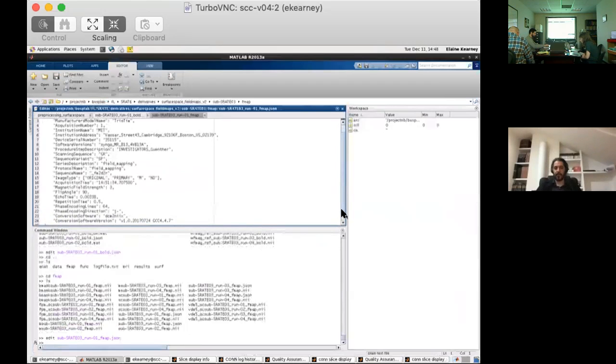So yeah, I would say try the same thing on every subject, basically just running every subject through this new pipeline version 2. And if this replicates, that the data is looking better across subjects, then we have a more confident result, and the directionality was basically the opposite of what we thought it was.